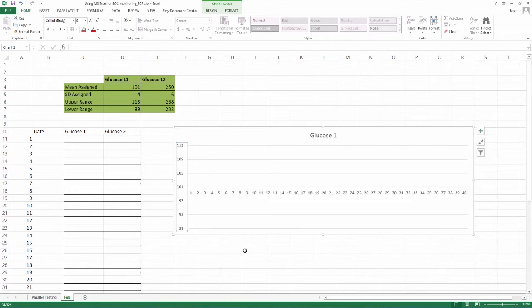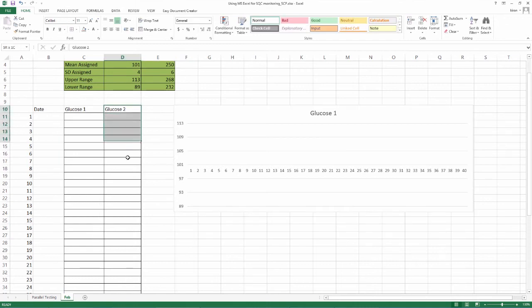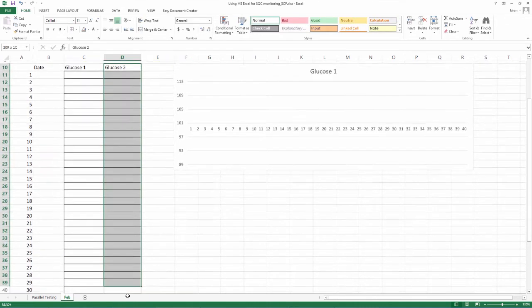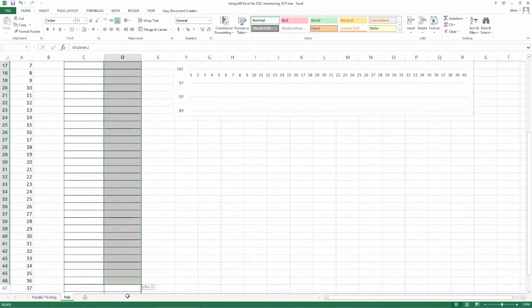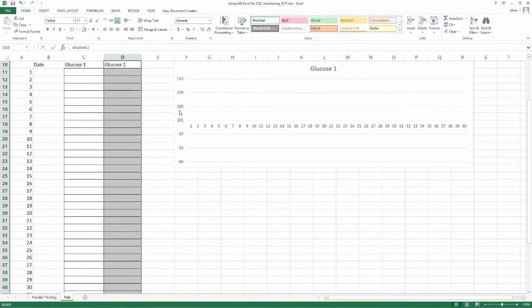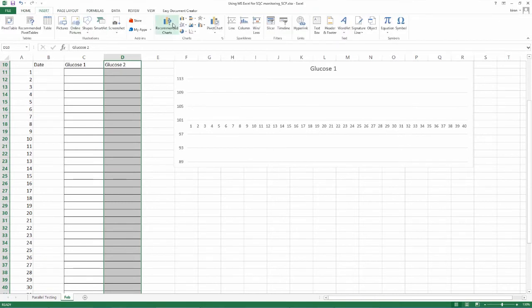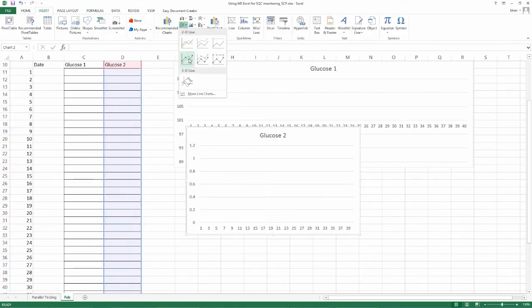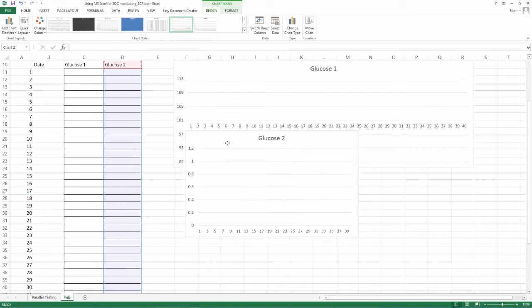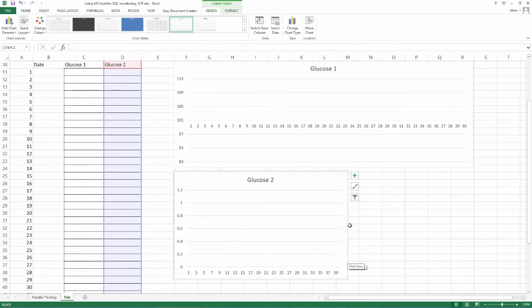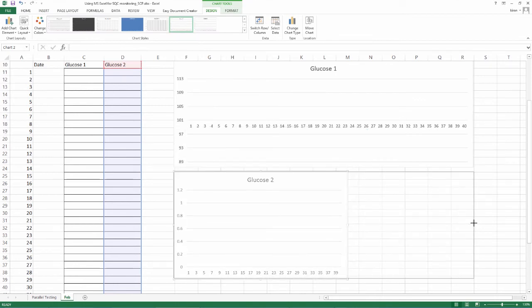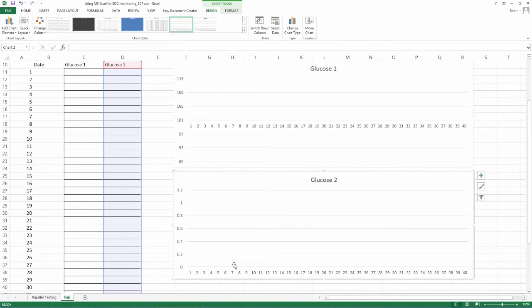You will see a neat graph for glucose level 1 valid for 40 runs where the mean, SDs and range is assigned correctly. Continue the same for level 2 of glucose so as to enable simultaneous visualization. Please note that while formatting axis, errors can happen. There is nothing to worry. Just reformat. With practice, this can be easily accomplished. So, now you have both graphs that can be used real-time and enable your equipment performance in a real-time manner.